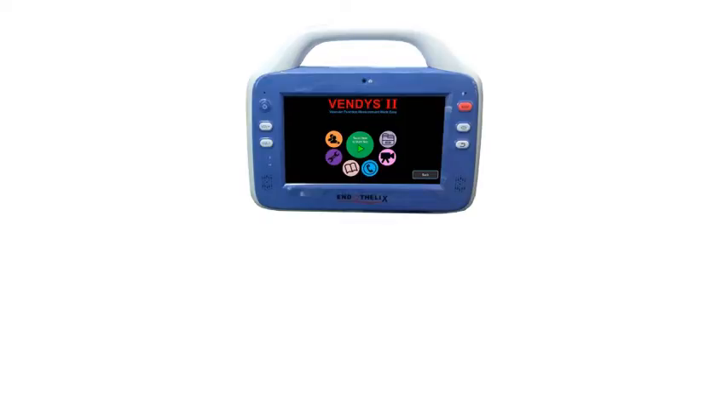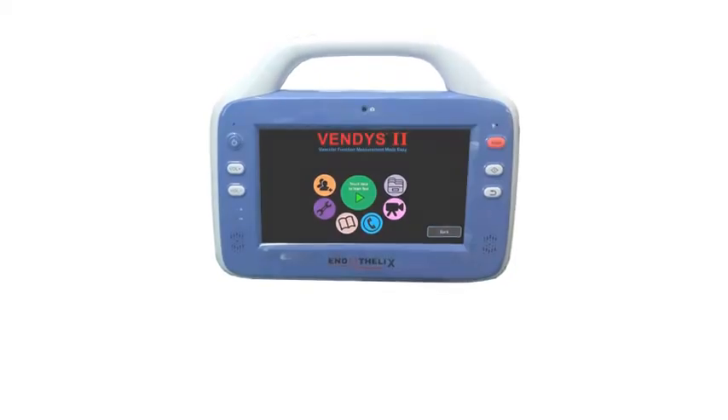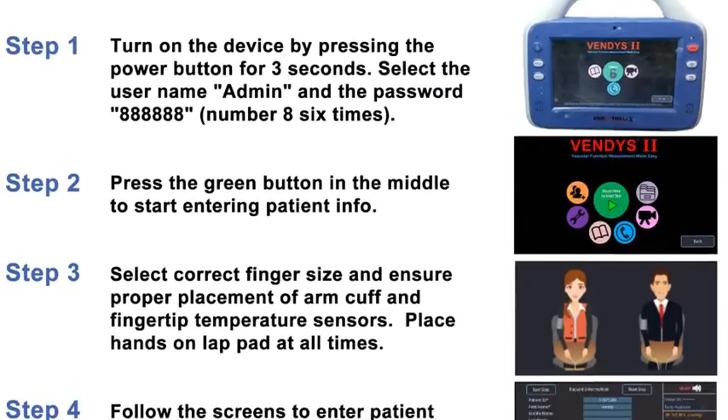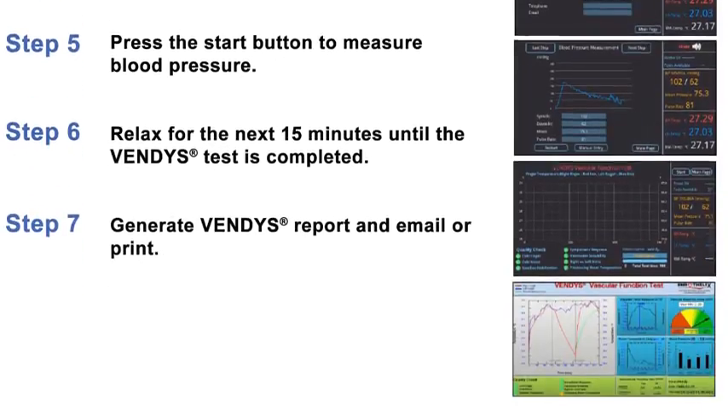Now that you have seen each component of Vendis 2, we're going to show you the product in action and actually perform a test. We will explain each step in detail and you will see how easily anyone can run a Vendis test.